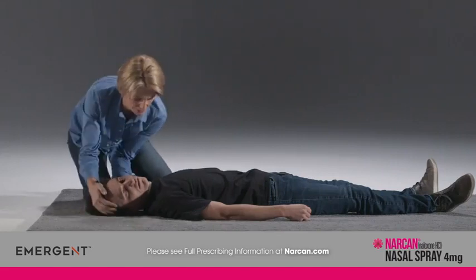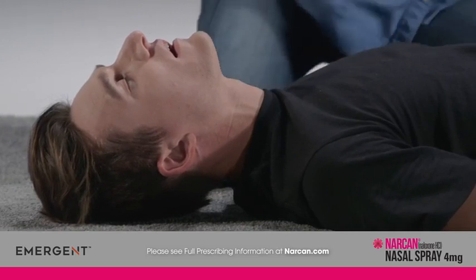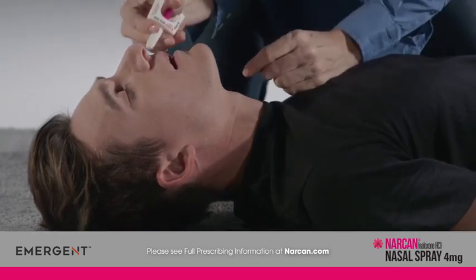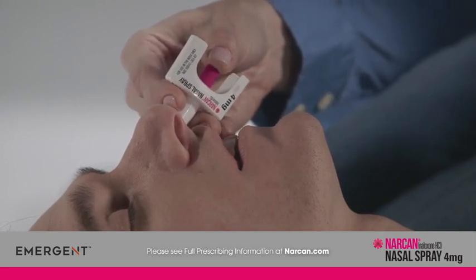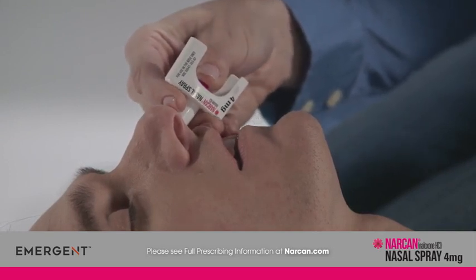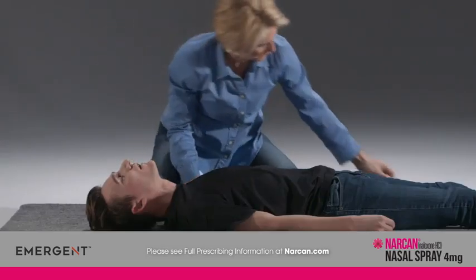Tilt the person's head back and provide support under the neck with your hand. Gently insert the tip of the nozzle into one nostril until your fingers on either side of the nozzle are against the person's nose. Press the plunger firmly to give the full dose of Narcan nasal spray. Remove the device from the nostril after giving the dose.